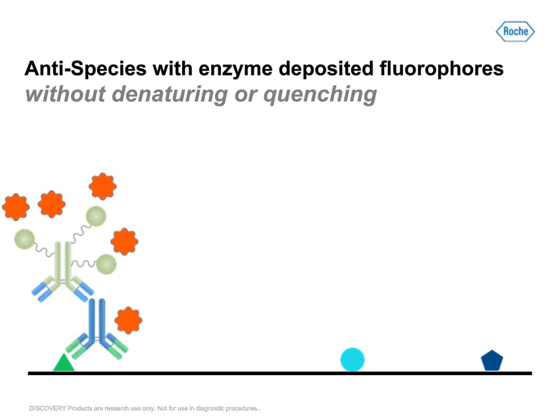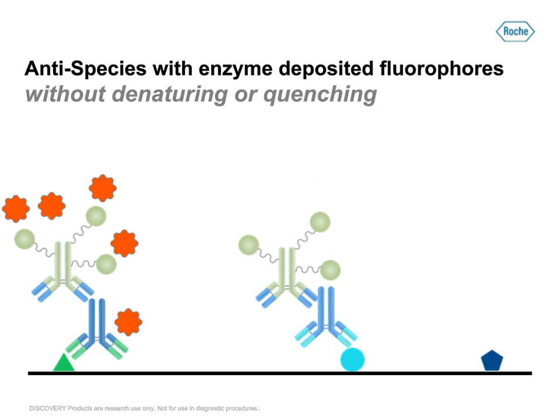And then you would come in with the second antibody that you're trying to detect, with the respective anti-species polymer HRP conjugate. But because you failed to elute that first sequence or quench any previously bound HRPs, you're driving a false colocalization.